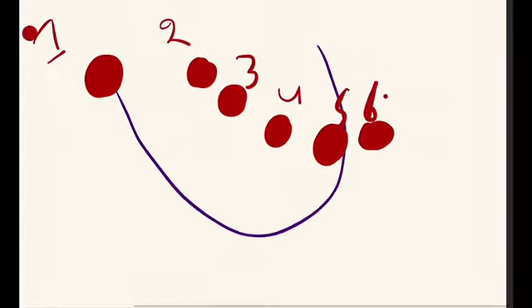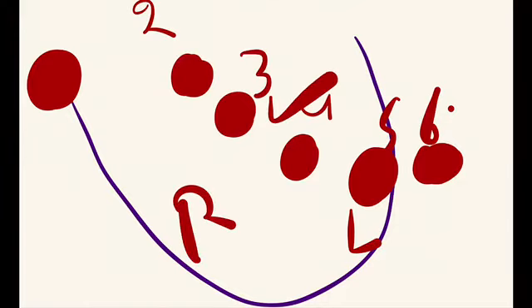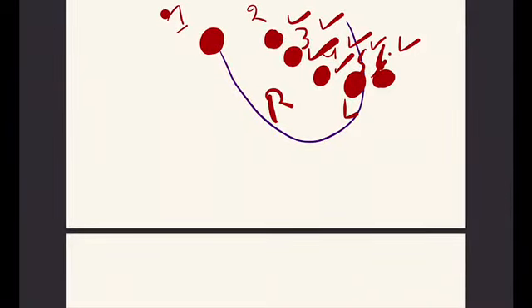If there is any problem in the anterior side of the left ventricle, this is left, this is right, the deflection and the Q wave can be seen in V3, V4 and V5. V2 can also be involved in this. In V2, V3, V4 and V5 we will be seeing the abnormal Q wave. We have already talked about the anterior and lateral surfaces. So anterior and lateral surfaces will include V3, V4, V5, V6 and lead 1 and VL. Lead 1 and VL are the leads that are looking three-dimensionally towards the heart.